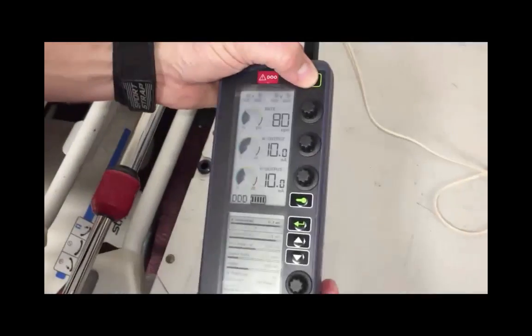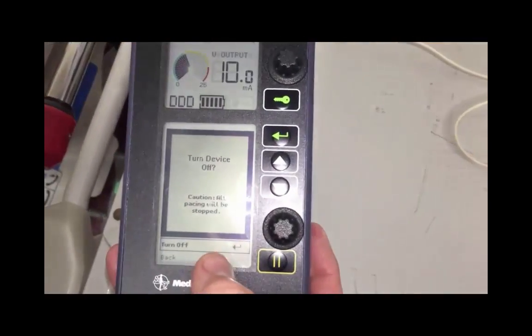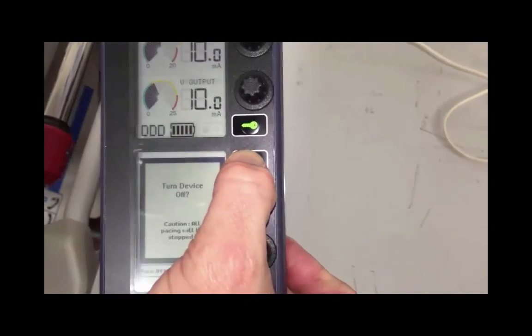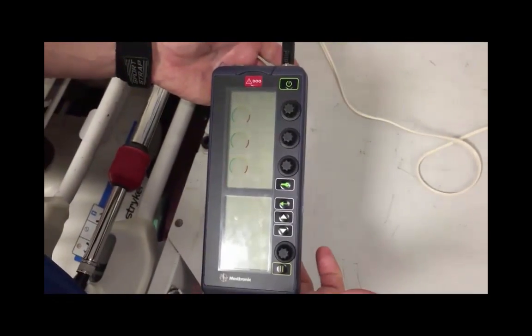In order to power the device off, simply push the power button at the top right hand corner. There is going to be a prompt to say turn device off. You hit the green arrow button at the bottom menu and the device powers off.